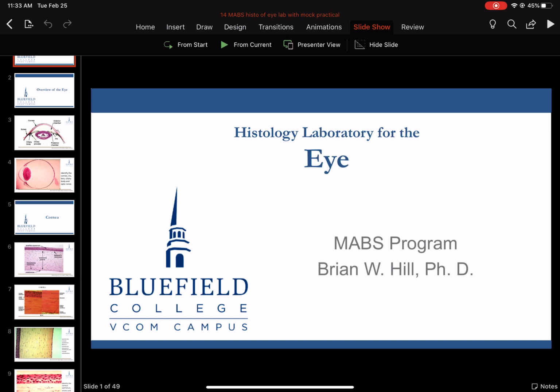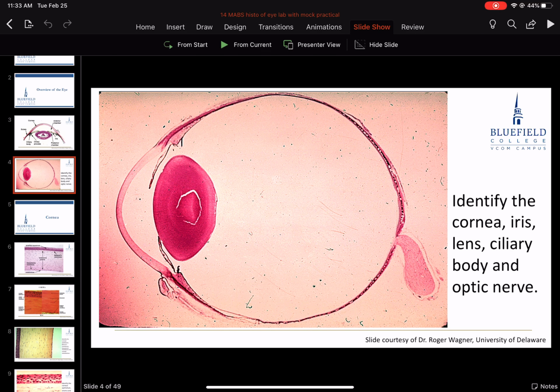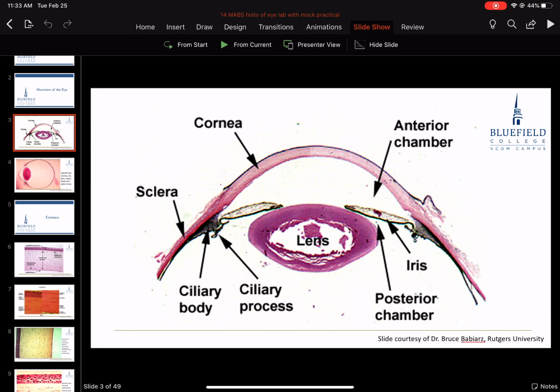Starting right here, ciliary processes. This is the cornea right here. This region right in here would be my limbus, making this pink coming back to my sclera. The line inside the sclera, well, we say choroid slash retina.